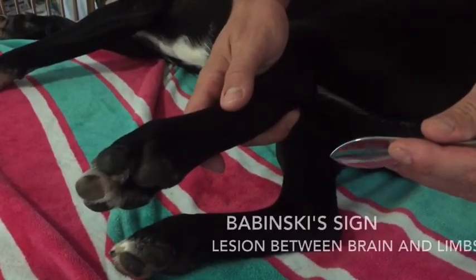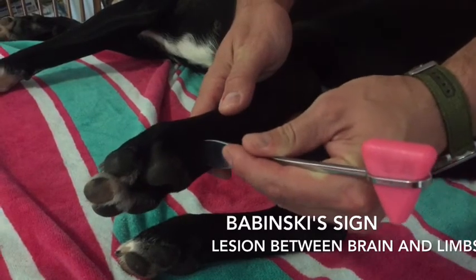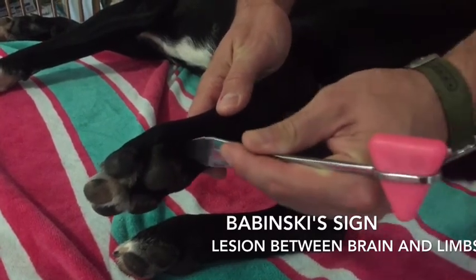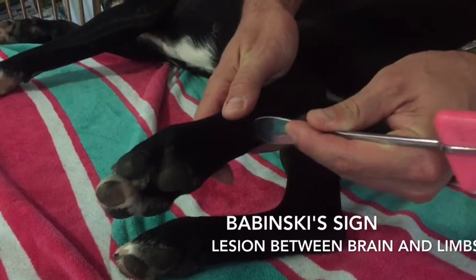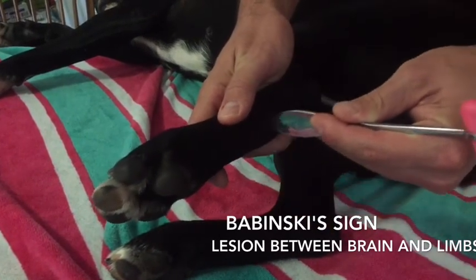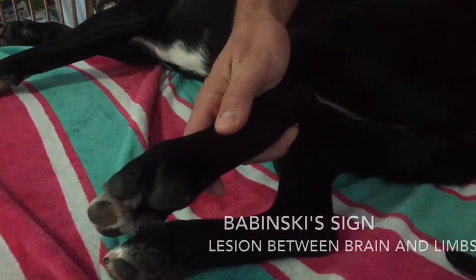Scraping the tip of the percussion hammer proximally on the metacarpal and metatarsal bones elicits slight flexion of the digits. Extension of the digits is a positive Babinski sign and indicates a lesion somewhere between the brain and C5, or the brain and L5.